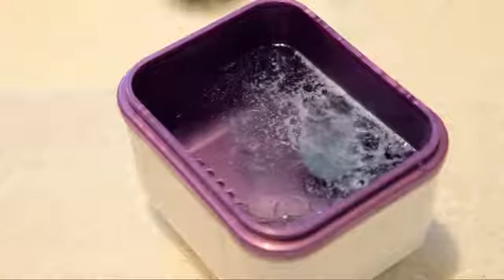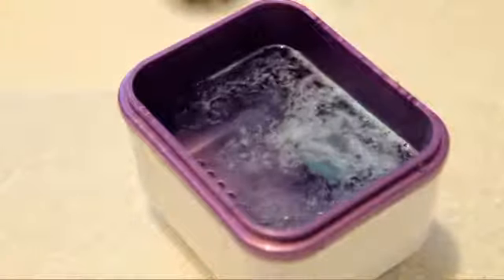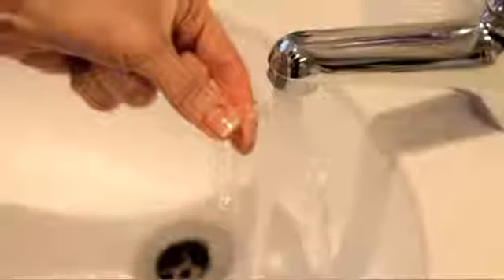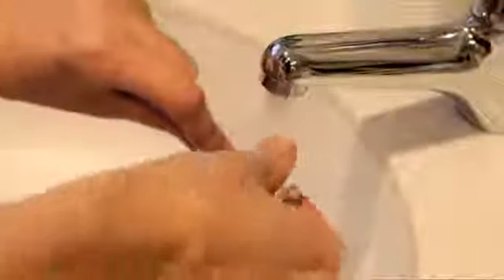This will fizz away and clean all the bacteria off your brace, and this process normally takes 10 to 20 minutes. Afterwards, thoroughly rinse the brace under cold water.